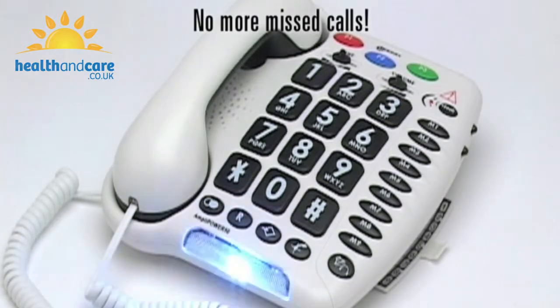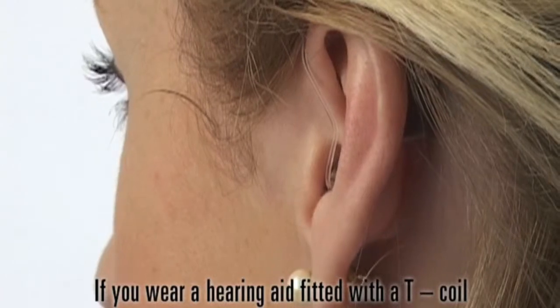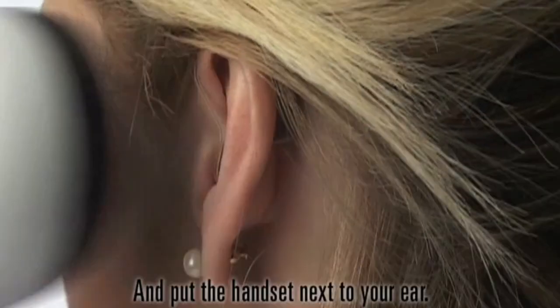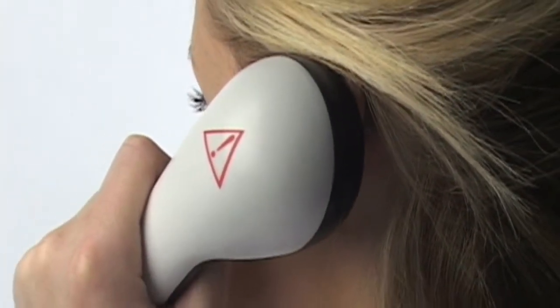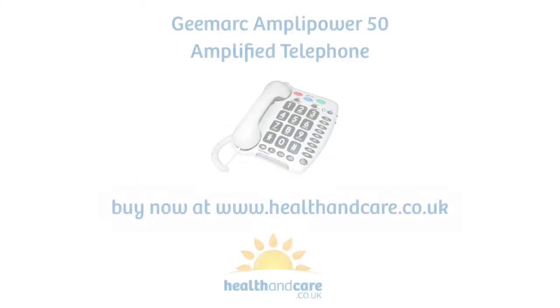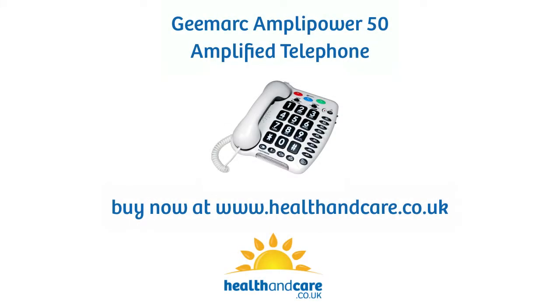No more missed calls. If you wear a hearing aid fitted with a T-coil, then all you have to do is move the T-coil switch to the T position and put the handset next to your ear. Hear the conversation clearly through your hearing aid.